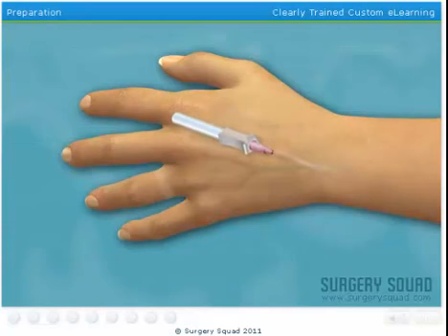The small burst of blood that you just saw in the angiocatheter hub is known as a flashback. This lets us know that the angiocatheter is correctly positioned in the vein. Now I'll release the tourniquet. While applying gentle pressure over the vein to collapse it, you can remove the needle. This will reduce the amount of blood that may pour out of the angiocatheter while the needle is removed. Once you remove the needle, I'll properly dispose of it in a sharps container.